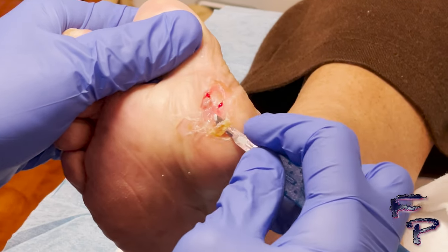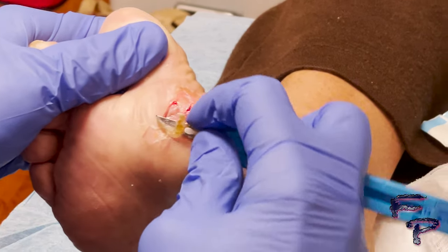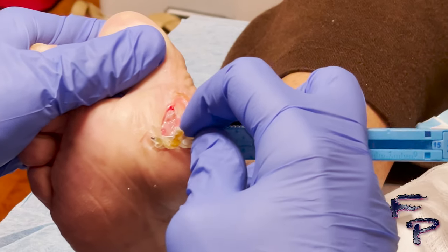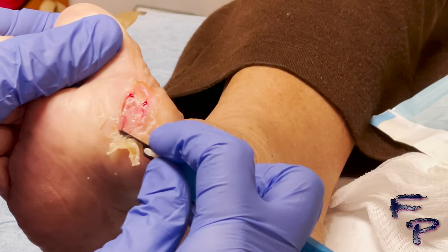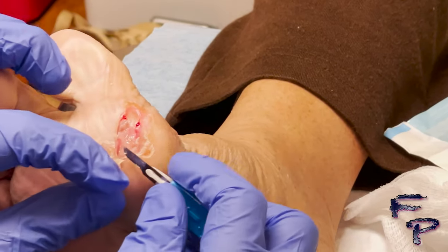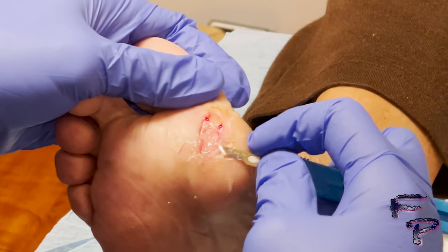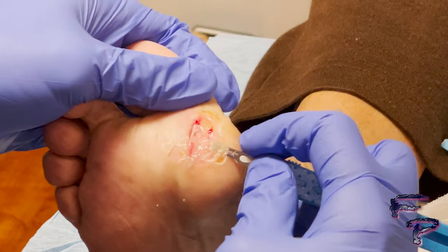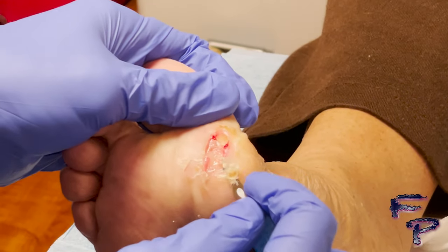Utilizing a number 15 blade, I make my way around the open wound. You have to be very careful because you have a blade — you can use pickups, though using your fingers is not recommended. I had pressed on the wound before and could feel that there's a thicker area of skin here.